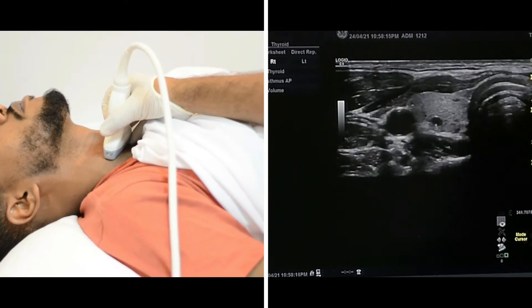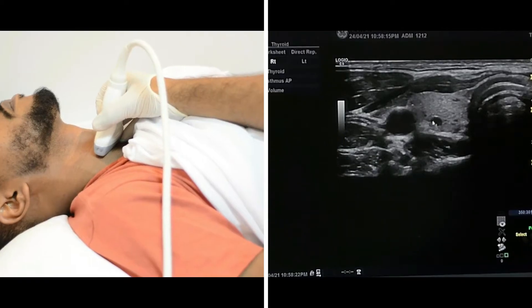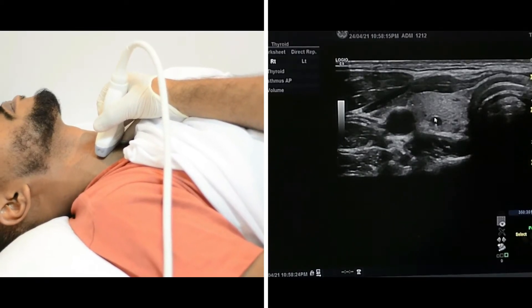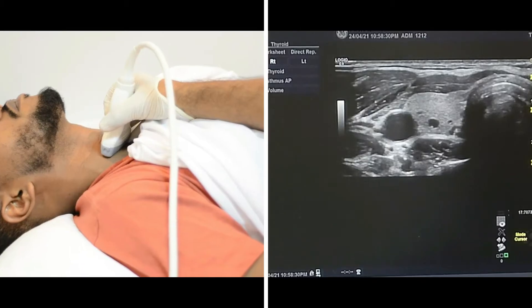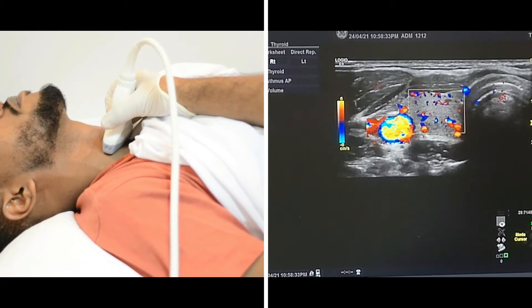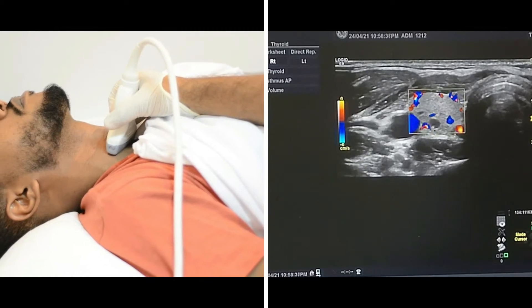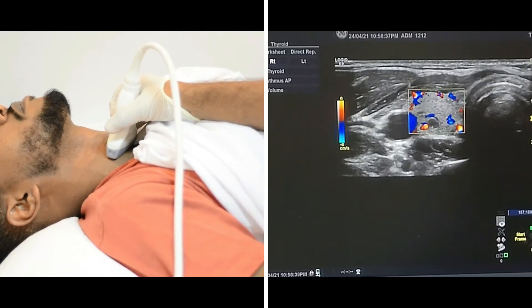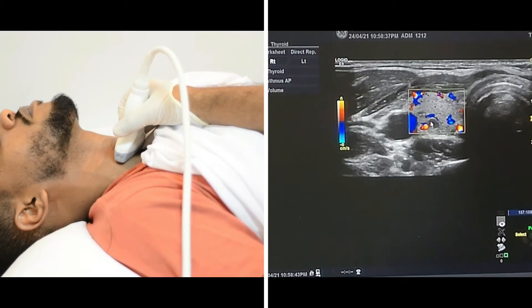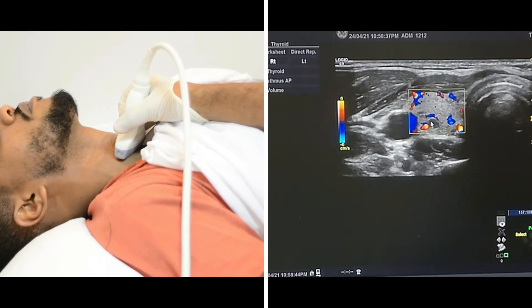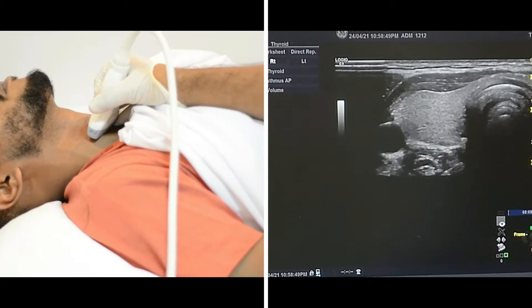As we can see here, we have by accident multiple cysts. In order to make sure that I'm dealing with cysts, I'm going to apply the color box to confirm there is no internal vascularity. As we can see here, there is no internal vascularity within this cystic lesion.